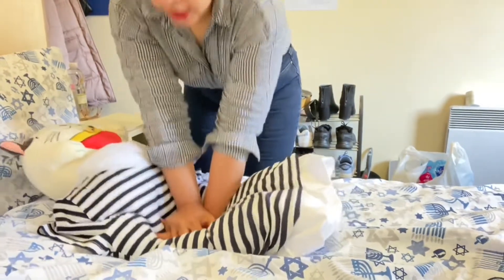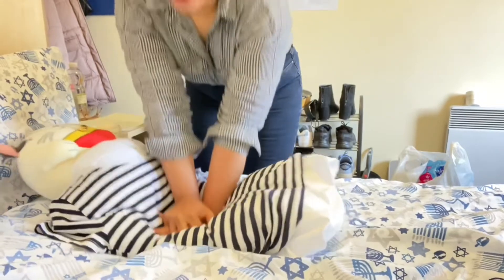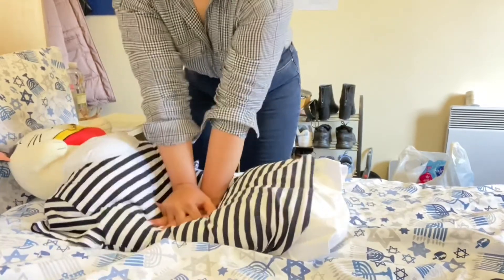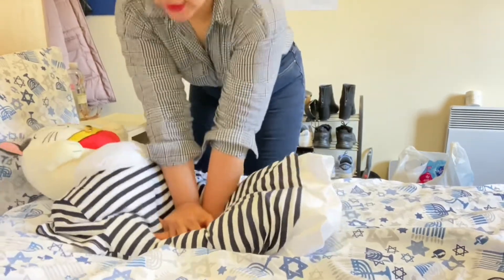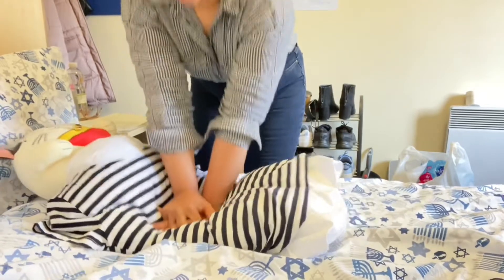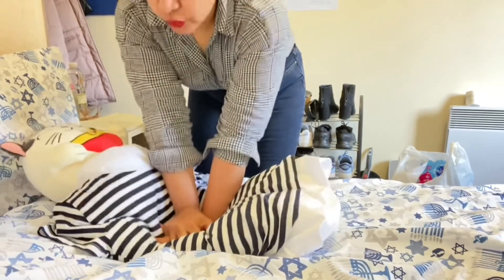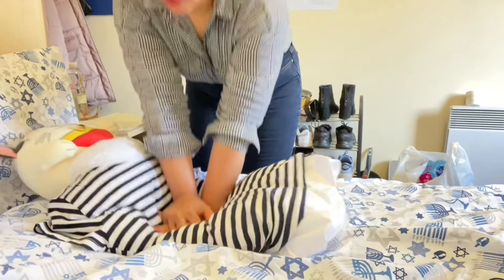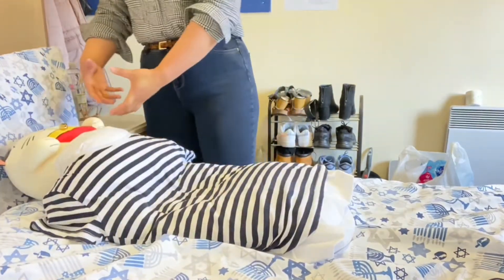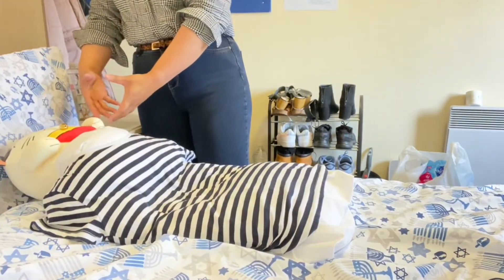2, 3, 4, 5, 6, 7, 8, 9, 10, 11, 12, 13, 14, 15, 16, 17, 18, 19, 20, 21, 22, 23, 24, 25, 26, 27, 28, 29, 30. 1, 2.